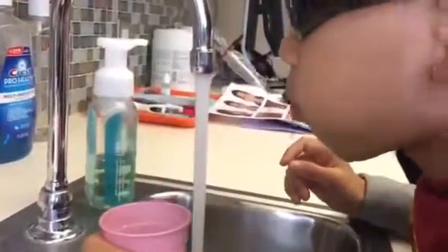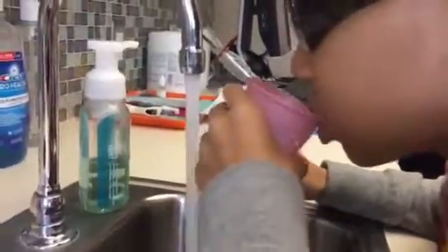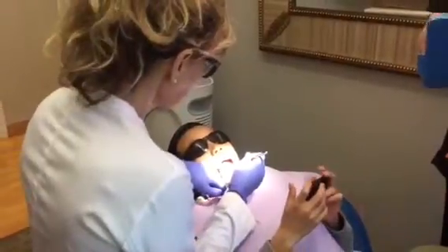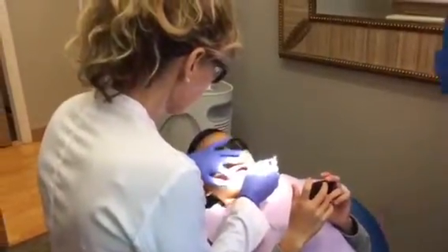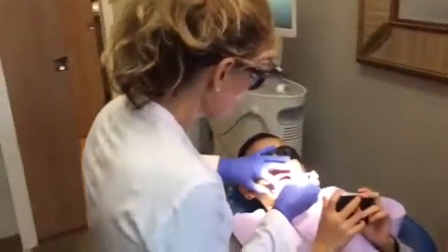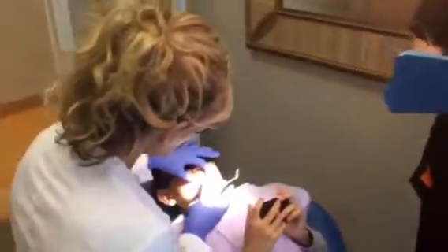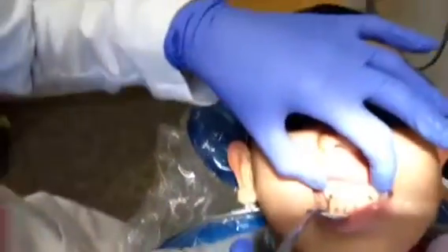Style braces — are we still on to metal? No. Oh my gosh, I'm glad I asked. Guys, I'm going to start the process of turning my teeth into braces. It's going to be awesome, it's going to be the best process. I'm not able to eat anything like pizza, so that's not good. His lower arch has a square shape, his gingiva is low on the lower ones, and his lower midline is skewed to the right. Severe. Shows to the right by three. OB is plus two. OJ is minus a half.